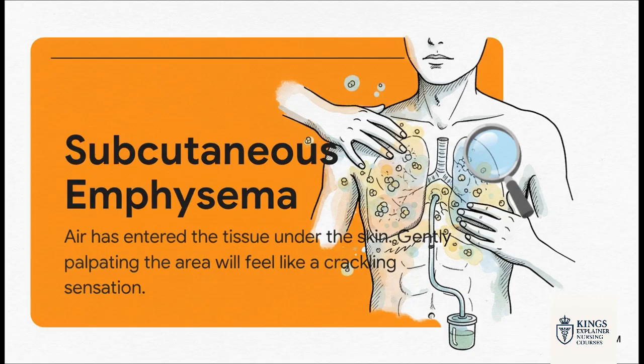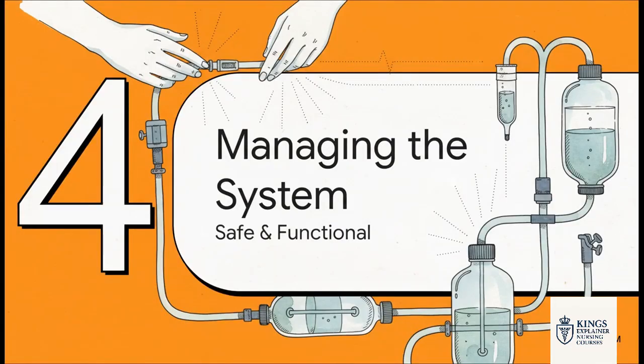And if you feel it, that means air has leaked into the skin tissue, which is a big deal. You need to assess that and report it. Okay, on to section 4.